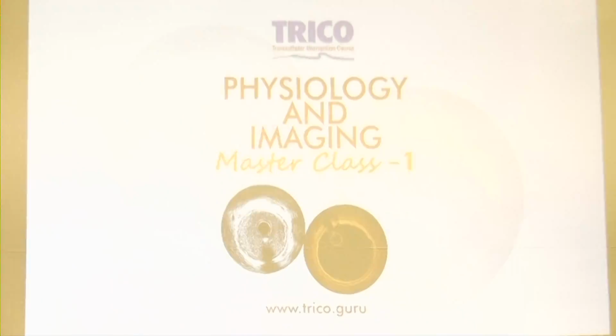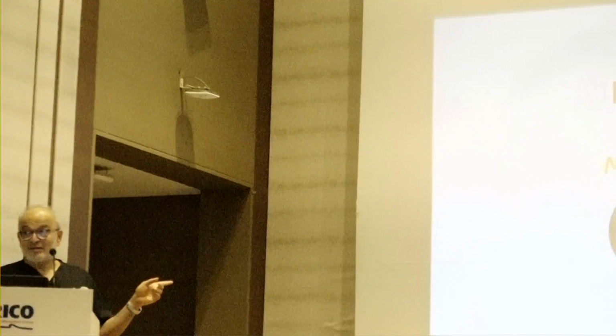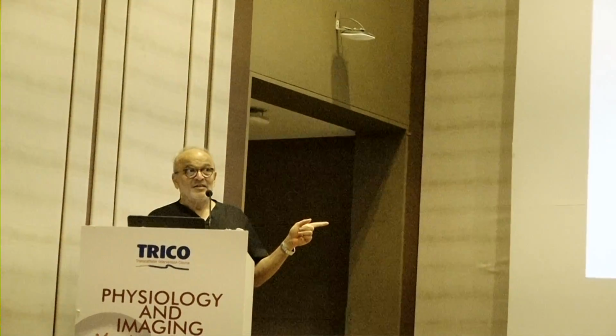And here, for obtuse marginal, you advise surgery or you exclude the circumflex, which can lead to mitral regurg, acute MR in this case. That was also not entering my head. So that is the reason why I took this approach. And restenosis is a treatable condition. Anyways, the patient will remain stable. That is what I felt. And with availability of good antiplatelet regime, normally our protocol is for first 4 months we give Brilinta and aspirin and then aspirin clopidogrel combination. These are the patients who are kept on Brilinta and aspirin for 1 good year.